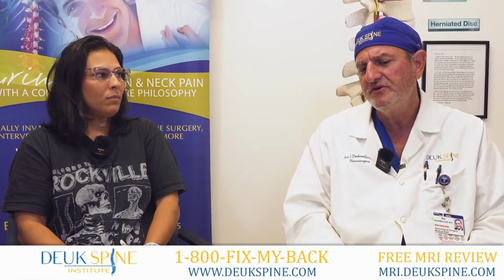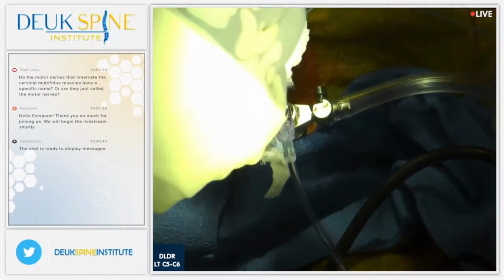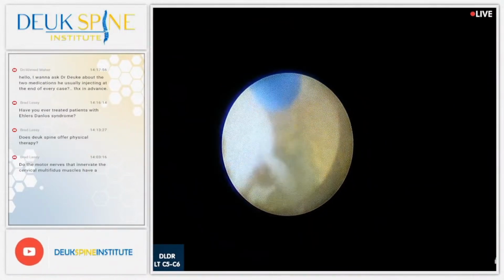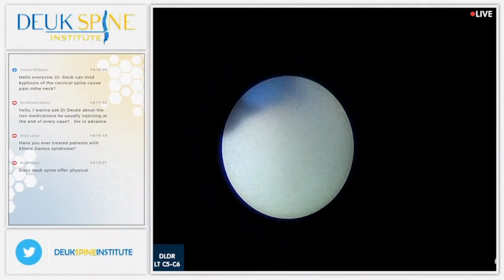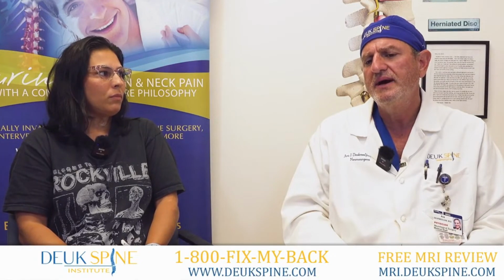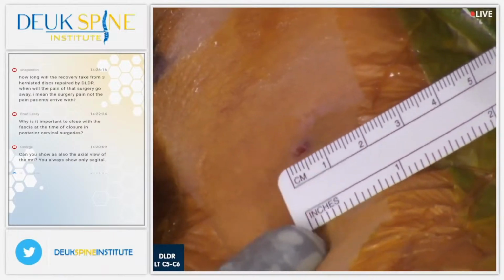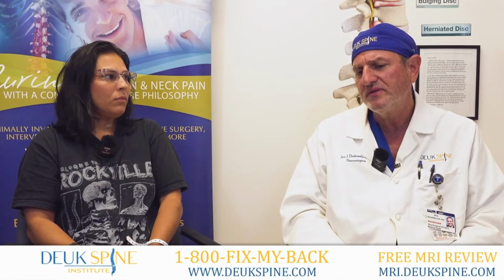You can see in your video here, we went into your disc, we used the laser. We actually pulled out several big chunks of herniation. I don't know if you watched your surgery, but you could see them coming out from the back of the disc. I cleaned the back of your disc beautifully, got the foramen opened up. There was nothing in there when I was done. Now your disc is going to heal naturally without any problems.